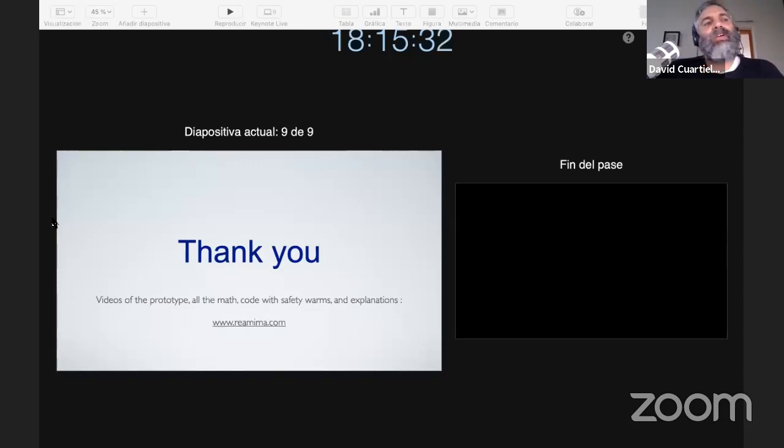Then also they're asking, which is the best Arduino board for this effort? For this effort, you need high precision, and it's necessary to get a time from the beginning to the end of the program of 10, 20 milliseconds. So I prefer to get a faster one that you can get in the shop. Okay. And then the other question is whether the water will have the needed speed to generate 20 BPM. I think you answered this question. You said yes, all the calculations are on your website. You can see all the math in the webpage. Okay, thank you very much.